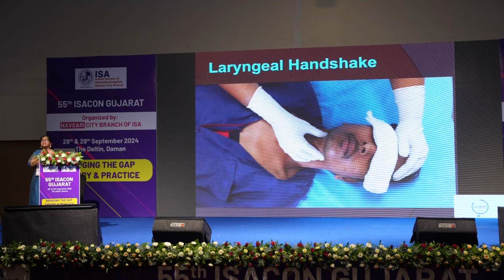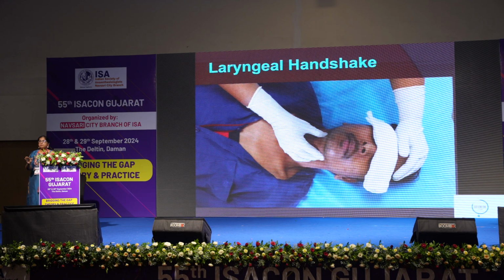So what do you palpate in the center now? Thyroid, right? Go below, go beneath. Next, the bony part which you palpate is your cricoid. And then you will find your finger actually dipping, falling in between the thyroid and cricoid, right? We have to go by this kind of approach, otherwise we will never be able to locate the cricothyroid membrane in an emergency, and preferably do it before. If you are anticipating difficulty, do it before, mark it, and then you can induce your patient.